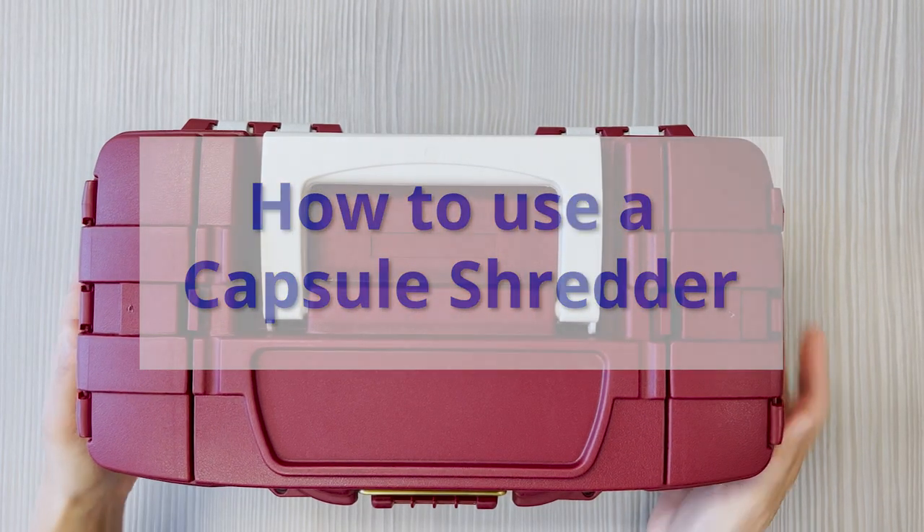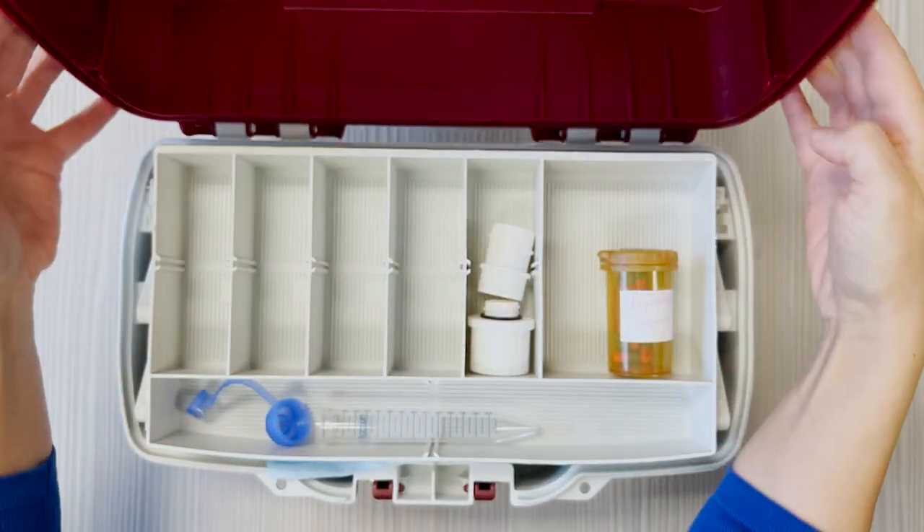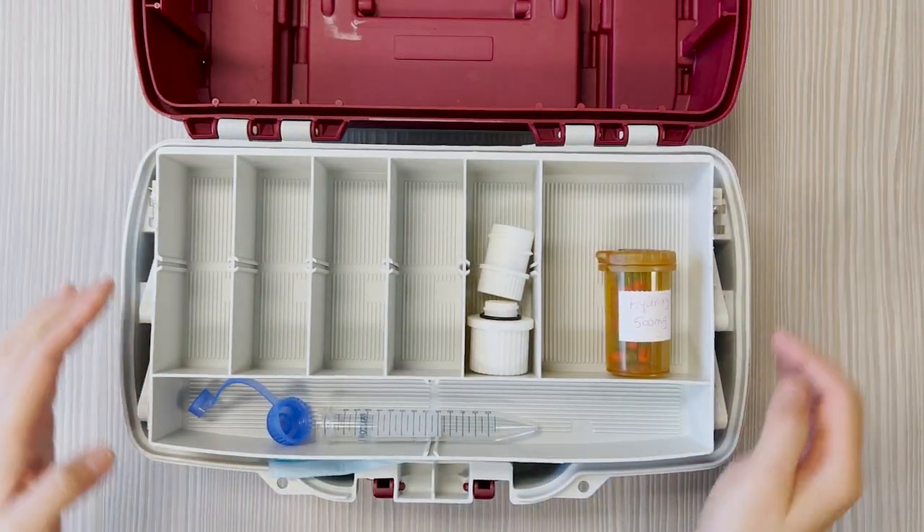How to use a capsule shredder. This video will show you how to use a capsule shredder with a dissolve and dose device to prepare capsule medications.